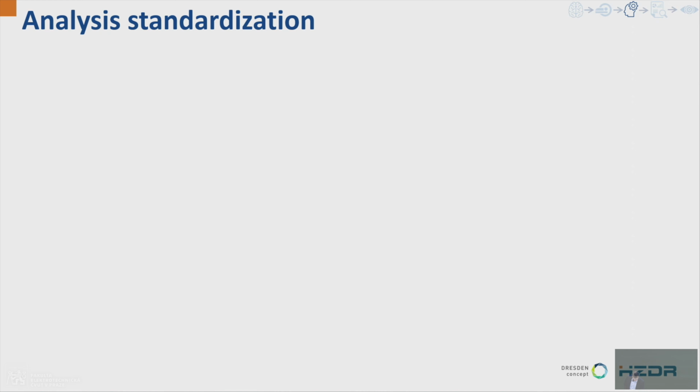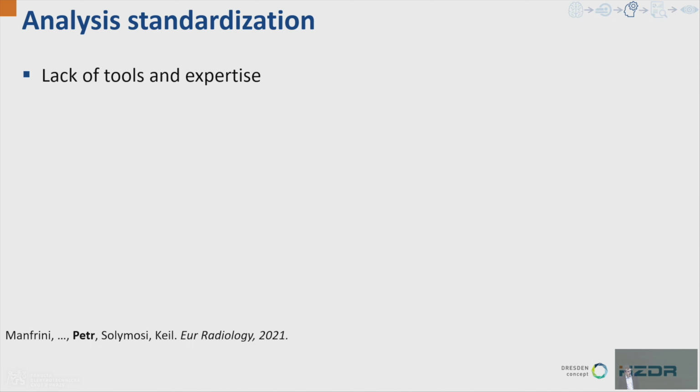A second issue with processing is that, again, it's not completely straightforward to process the data, as especially medical doctors are not really used to working with quantitative data. So we made an EU-wide survey where we asked medical doctors from hospitals all around Europe whether they are using ASL, and if not, then why not? And most of them said that the lack of tools and training is the main hurdle that stands in their way.